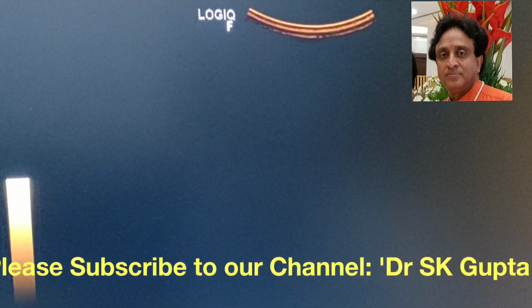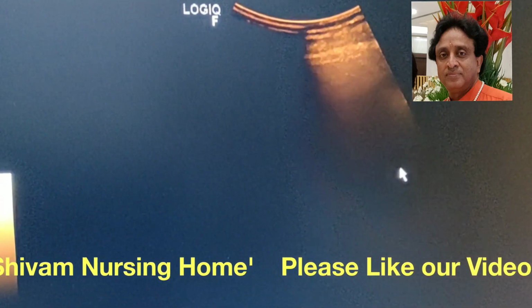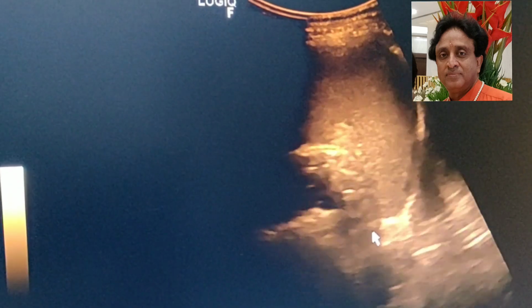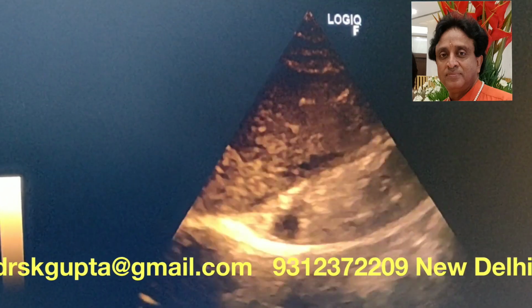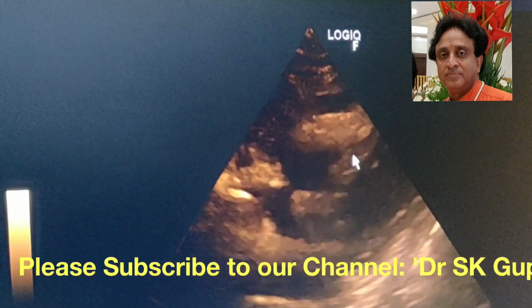There is no free fluid in the cavity, but there is some fluid around the spleen. There is no free fluid in the costophrenic angle, so there is no pleural effusion. Now try to look for the heart. You can see that this is the heart, and there is no significant pericardial effusion.